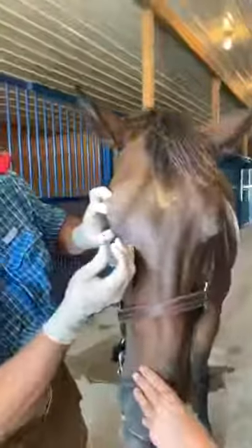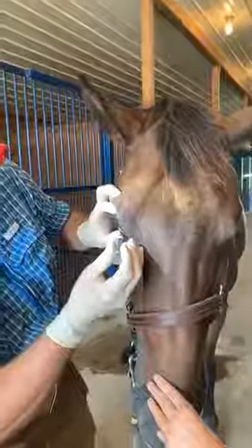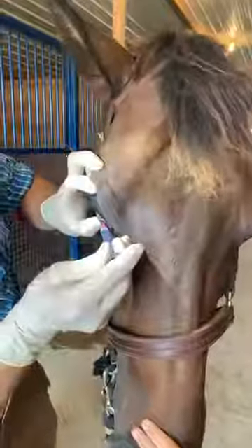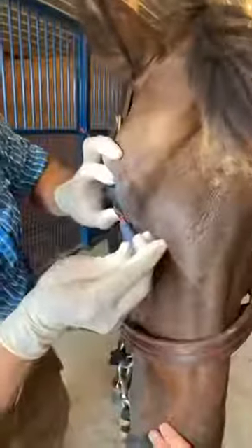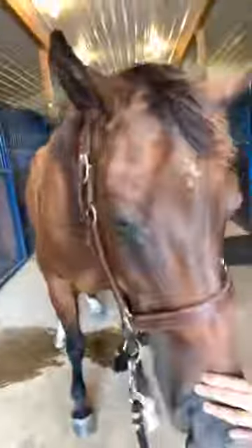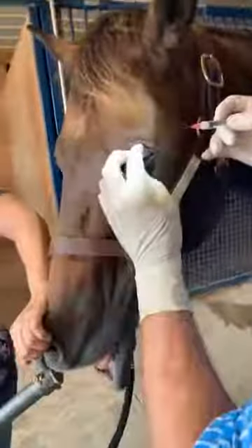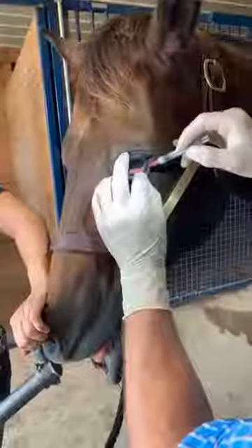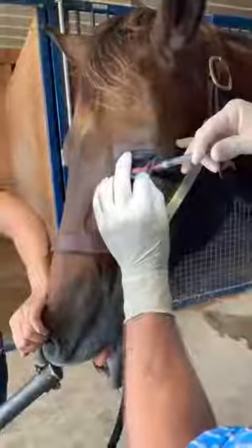So if you are squeamish, you may want to look away, but trust me, he has been sedated and numbed, so this will not hurt him. And we are not going actually into the eyeball itself. We're going into, like I said, the subpalpebral area, pretty much the lower lid. You can do the upper lid and the lower lid. If you didn't hear that, Dr. Reiners said you can do the upper lid, but the lower lid is just easier and more comfortable. Doesn't even flinch, he's all blocked.